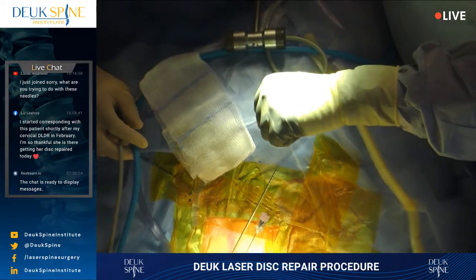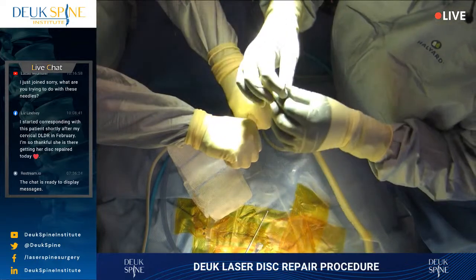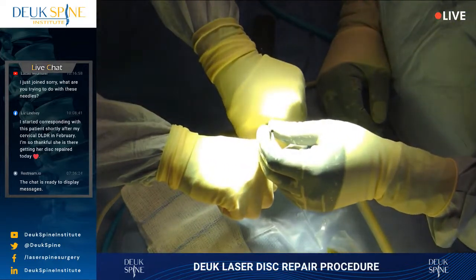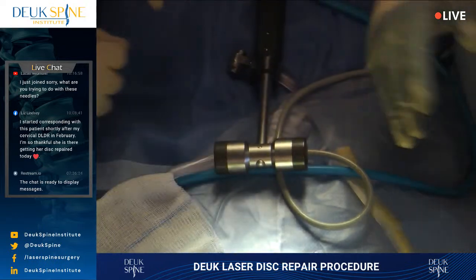So when I started, put your hands up. I'll use Luis's vertebrae. There's the disc space. So I started at kind of an angle like this, and it hit the top of the end plate, and then I brought it down as I advanced it, so it's sliding now parallel to the end plates. All right? So I feel really good.